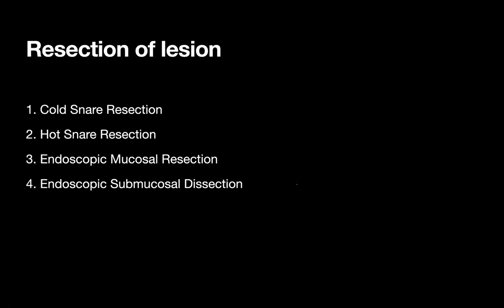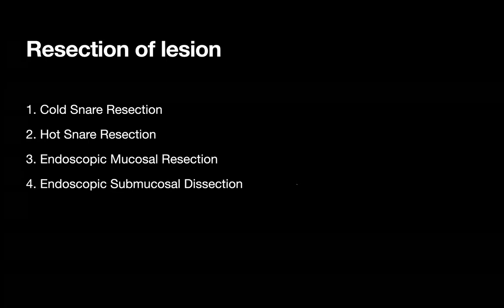And I think to downgrade the resection and make it into something that has a higher risk for residual to come up on the resection site, by making it into what I used to call a corned beef resection, where you cut it into small pieces, is really bad medicine.